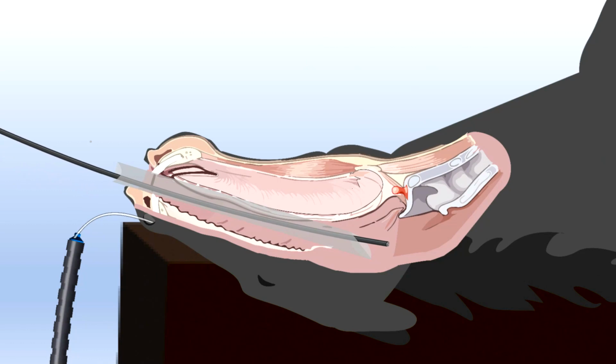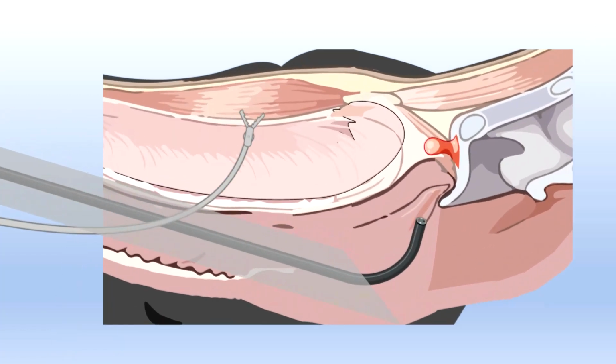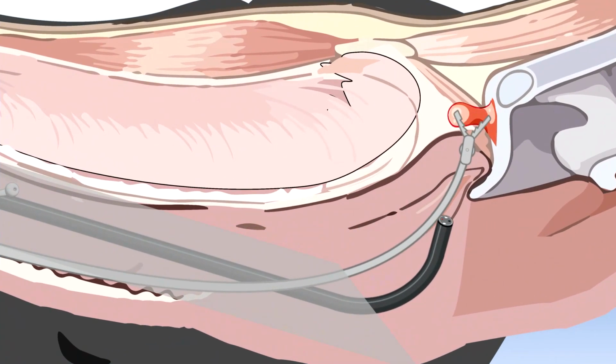A flexible endoscope and a bronchoesophageal forceps are passed through the speculum, and then the forceps are used to grasp the mucosal surface of the cyst and rotate it. The Chambers catheter is introduced and used as a guide to the snare.